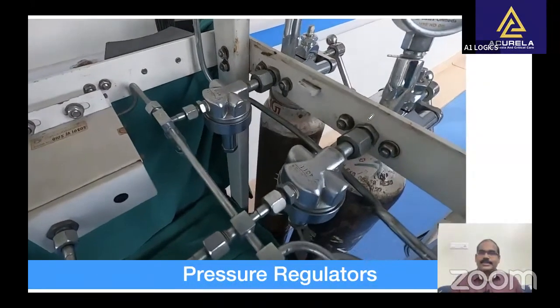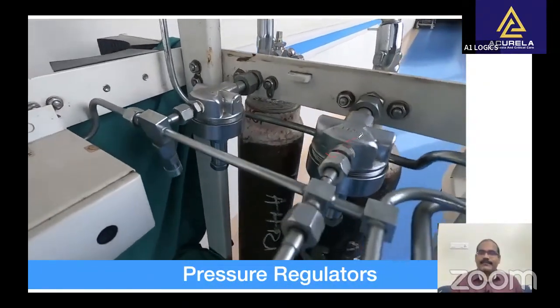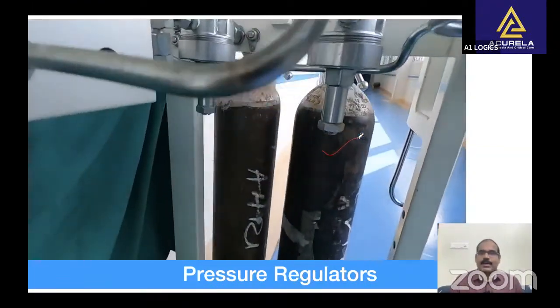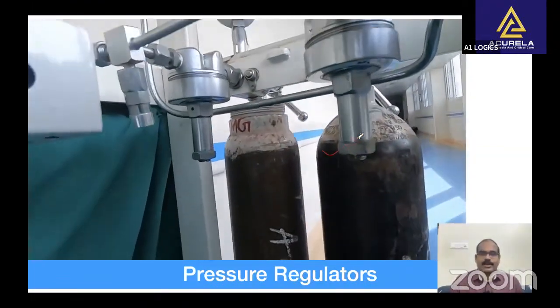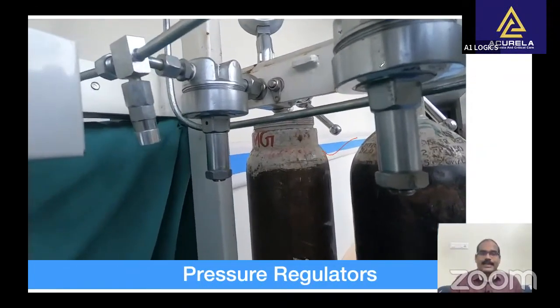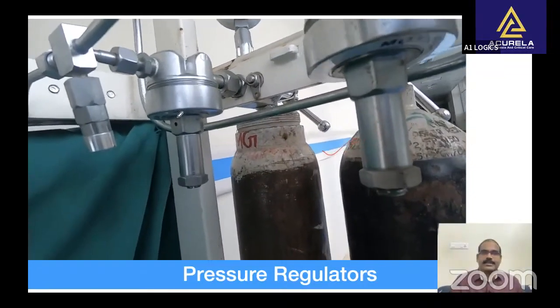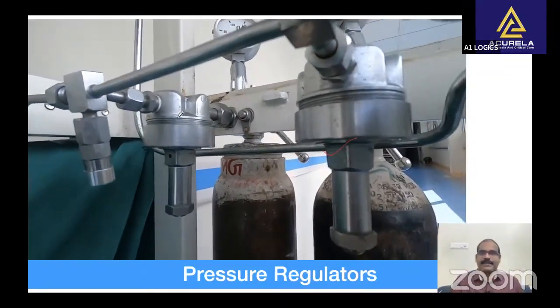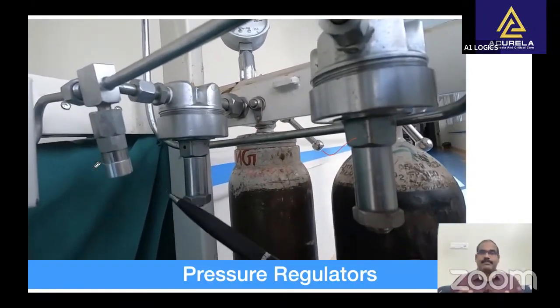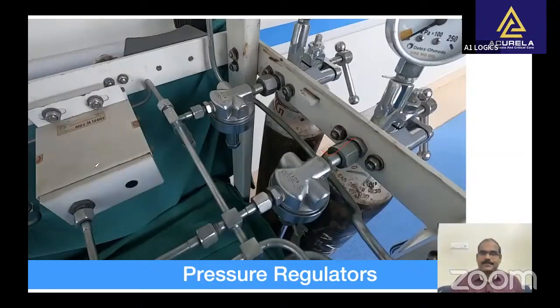Pressure regulators used in anesthesia machines are preset at the factory. One regulator may serve a single or a dual hanger yoke. Here you can see the pressure regulator and the factory set. This is the mainspring, and there is a safety valve also, in case excess pressure builds at the level of pressure regulators.